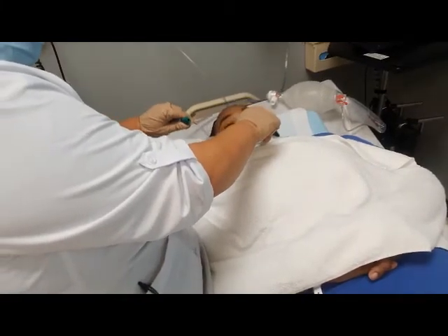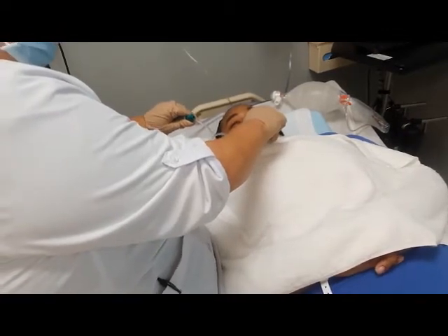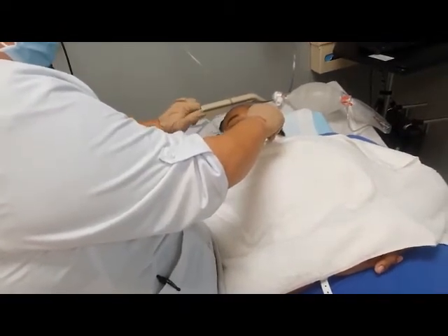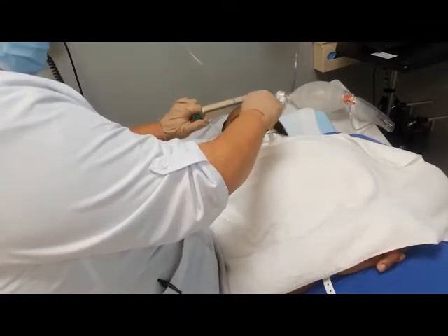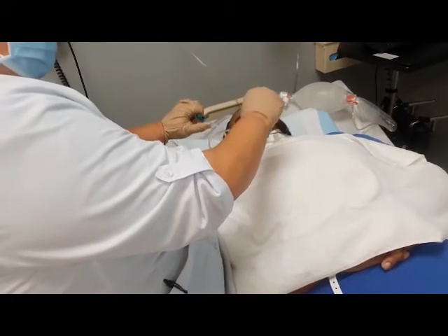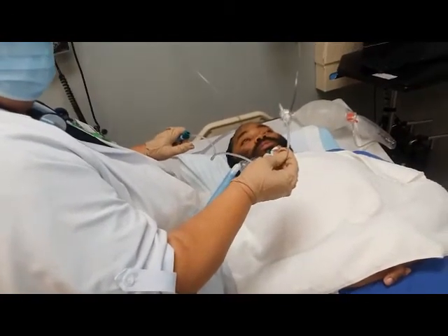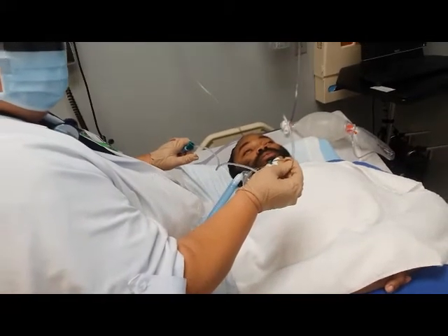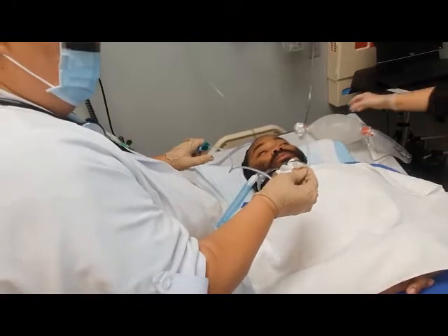Okay. Then once you reach about right in here, the patient's going to start coughing. You withdraw the catheter slightly, then apply suction continuously, but for no more than 10 to 15 seconds. 2, 3, 4, 5, 6, 7, 8, 9, 10. Gently twist back and forth as it's withdrawn completely, taking care not to contaminate the catheter. At this point, you can hyperoxygenate the client again and allow their oxygenation to return to baseline.